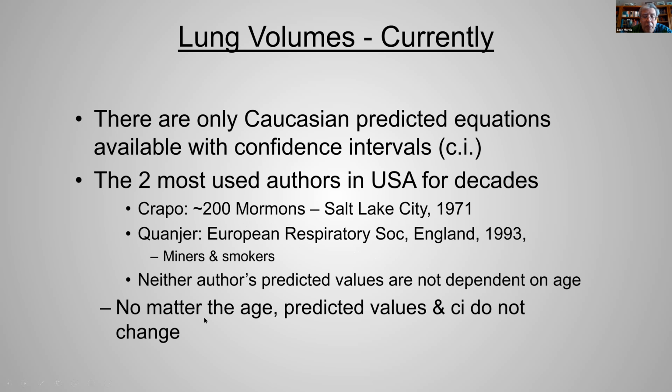Now, what's kind of interesting also is that neither author's predicted values are dependent on age. In other words, no matter what your age is, if your size and height are the same, your TLC is going to be the same. And not just the predicted values don't change with age, but also the confidence intervals do not change.